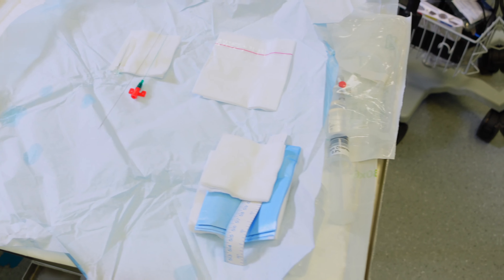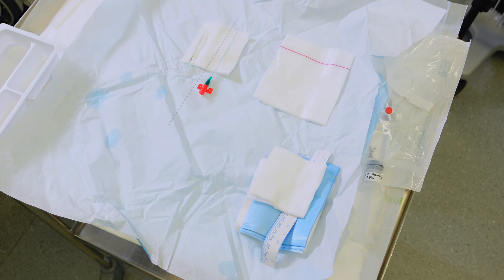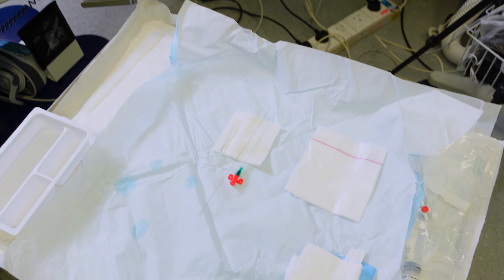There are lots of different types of arterial lines available, and locally we refer to these mostly by their brand names. There are different ways to insert them. The one we're going to show you today is inserted using Seldinger Technique, and locally we call this a Vigon. However, the companies make lots of different types of arterial lines, some of which are inserted using Seldinger Technique, and some of which are inserted like an IV cannula. So double-check your equipment before you start your procedure.